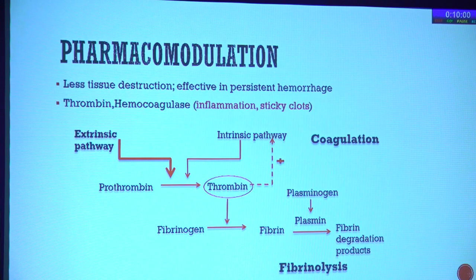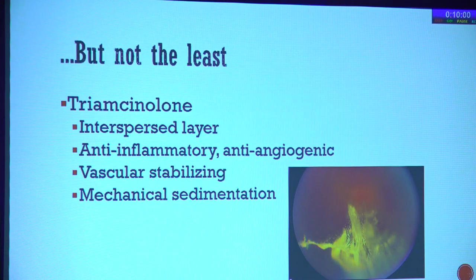So most of the cases are managed with topical steroids. And last but not the least, I would want to highlight the importance of triamcinolone. We use it as an agent to identify the vitreous, but in addition to that, the interspersed layer of triamcinolone, which is lying over the retina, will not allow the clot to stick onto the retina.